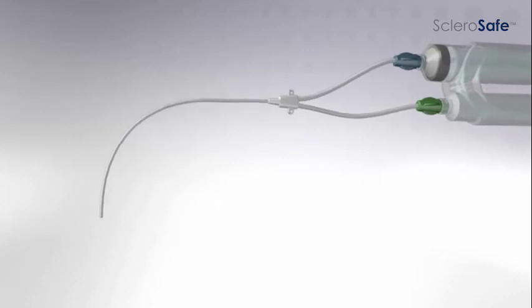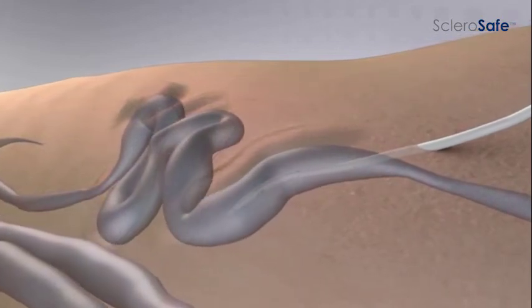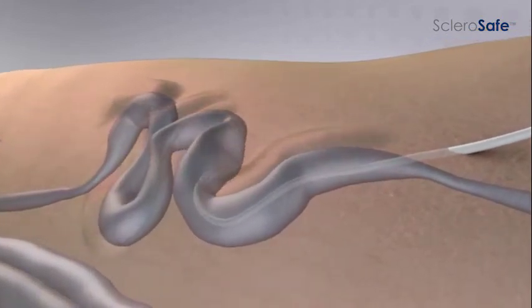The SclerosAfe double lumen catheter is then advanced over the wire to the end of the treated vein. Its proper position is confirmed with ultrasound.